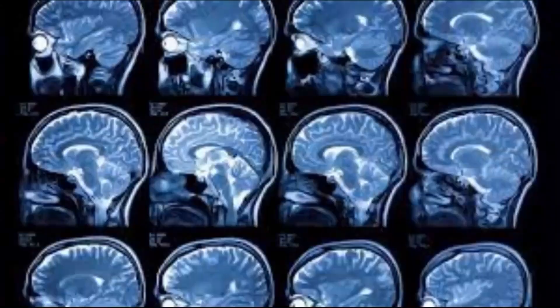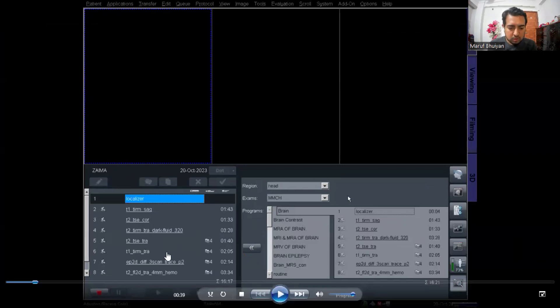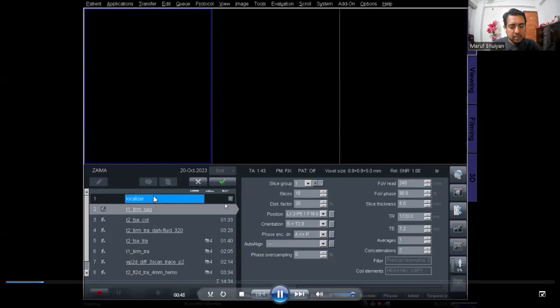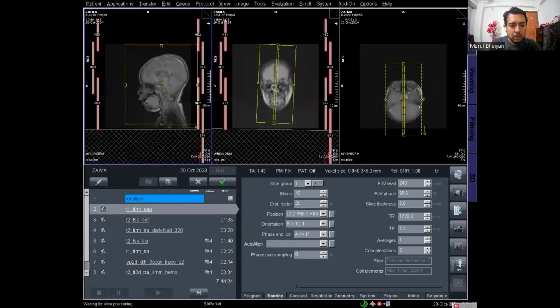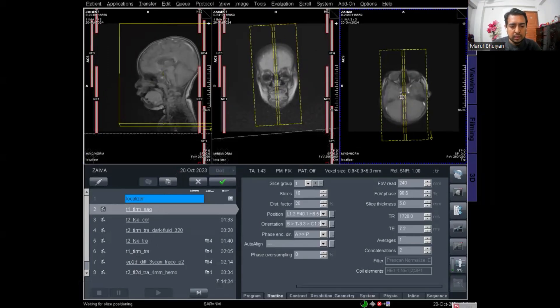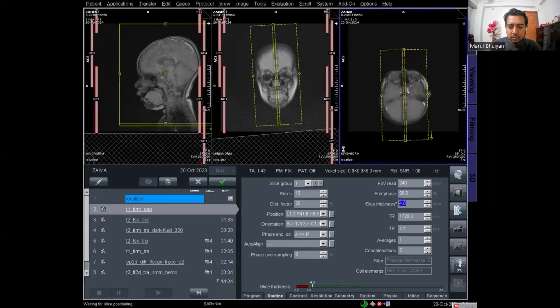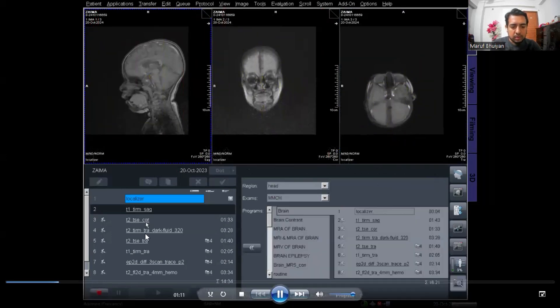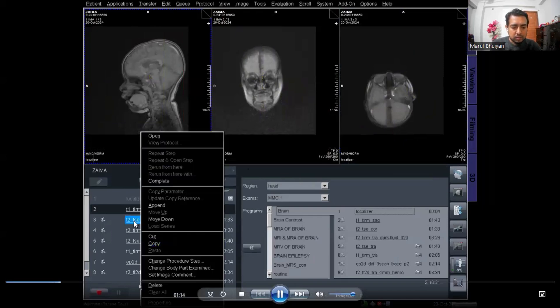Let's start the MRI brain epilepsy protocol. I have taken the protocols from brain — all routine brain protocols will be taken — and two epilepsy protocols I will select for this patient. The localizer is scanning for the brain, and now I will plan the T1 sagittal for the whole brain. The slice thickness is decreased to 4 because the patient is a child.